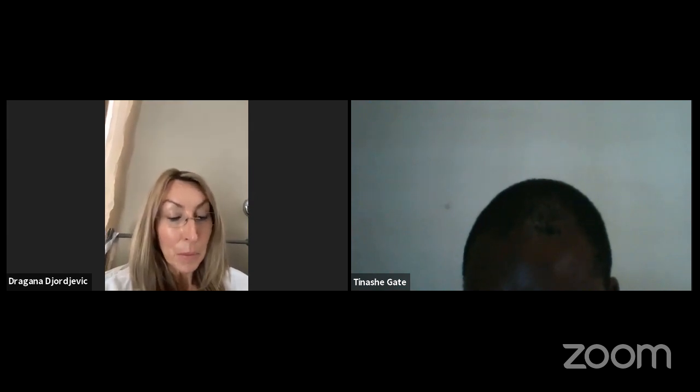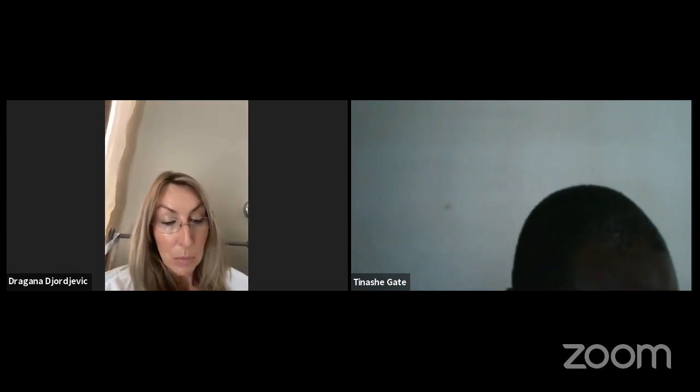Hello. Good afternoon. Mr. Eton Buma, thank you so much for your question. The difference here with the 1-chip and the 3-chip camera, here we're talking about chips, the sensors that capture the images. When you are talking about a 1-chip, we've got one chip that is capturing the images. And when we talk about the 3-chip, we've got 3 chips which are trying to capture the same image that the one chip is also capturing. So you can actually see the difference here, that with the 3 chip, you are getting a better image because of the resolution that we are going to capture.